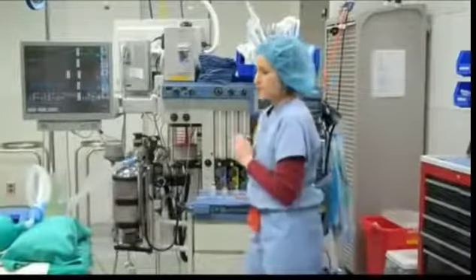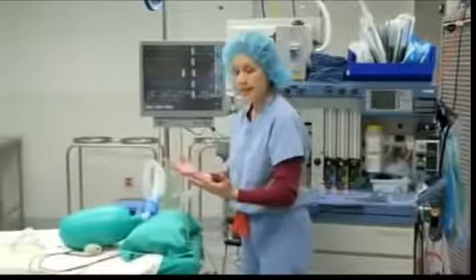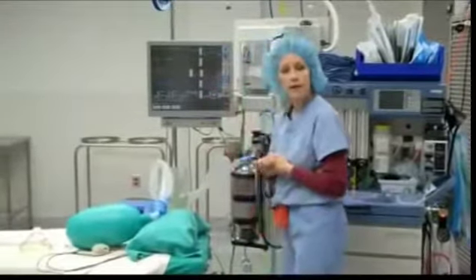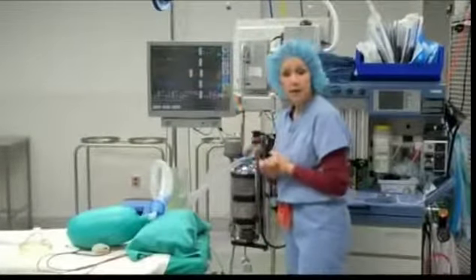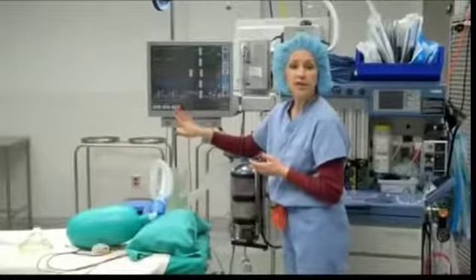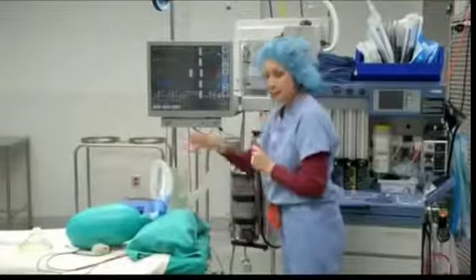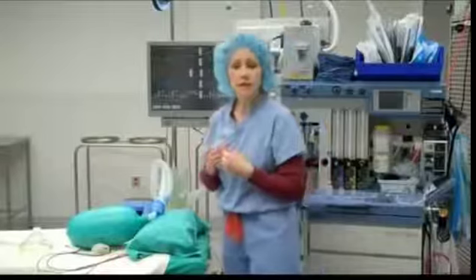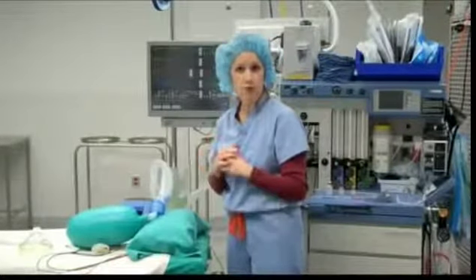Okay? So during surgery, we are then able to maintain the patient's status. We are constantly looking at the heart rate and the heart rhythm. We're looking at blood pressure monitoring, and we're also able to look at the percentage of anesthesia gas being delivered to the patient and the anesthetic gas that's coming from the patient. Okay. We also can deliver additional pain medications, additional medications to relax the muscles for surgery.